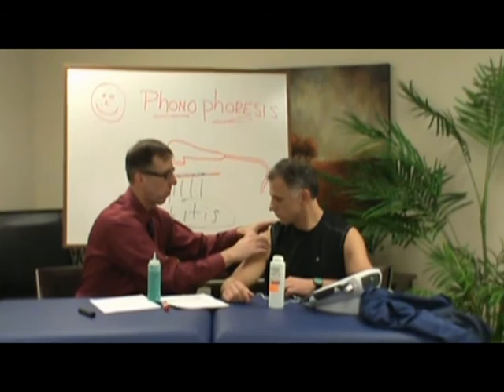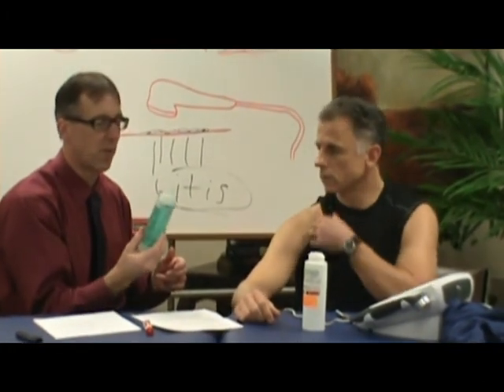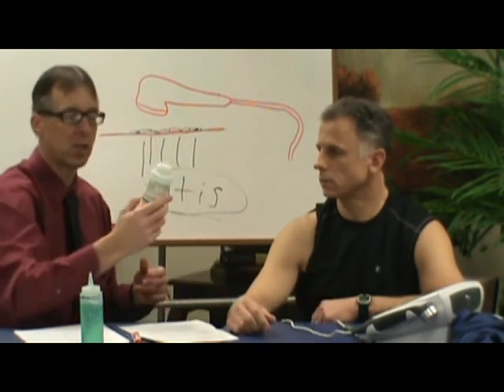Otherwise, a lot of people think this whole area is the shoulder. Really, the shoulder is from this point and down, so that's where the phonophoresis would be. Now this is just a gel. You use this if you are not going to apply any medication. This is the medication we're using here today.